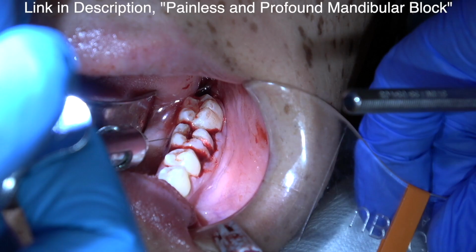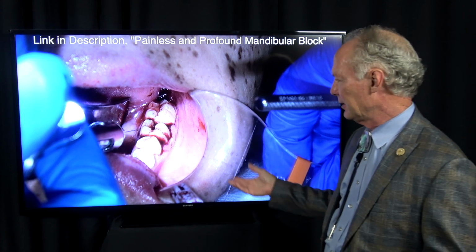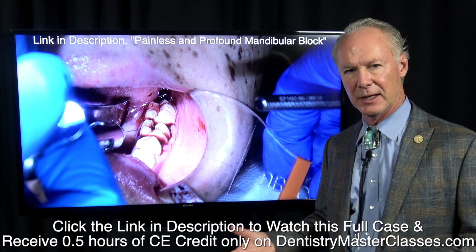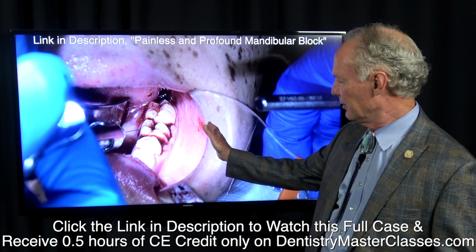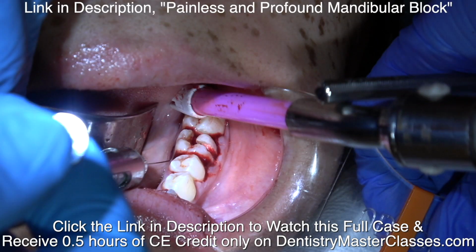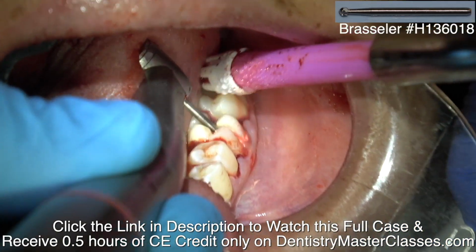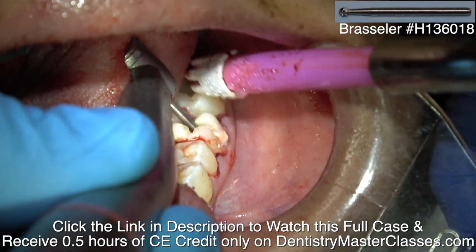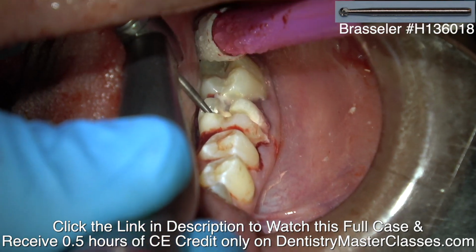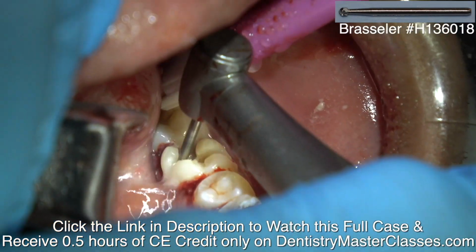Now, I've took out a wisdom tooth back here, so you see some bleeding. One of the important things when you're extracting a tooth, especially if you're planning on placing an implant, is you maintain the facial bone and the lingual bone or the palatal bone. So I want to remove this tooth in pieces. I don't want to lose the buccal bone or the facial bone when I extract the tooth, because I need that bone to form a cup for the bone graft. We'll talk about bone grafting here in just a minute once I extract the tooth.